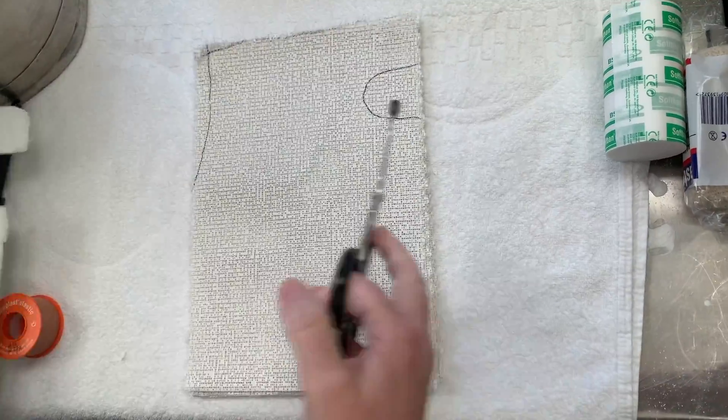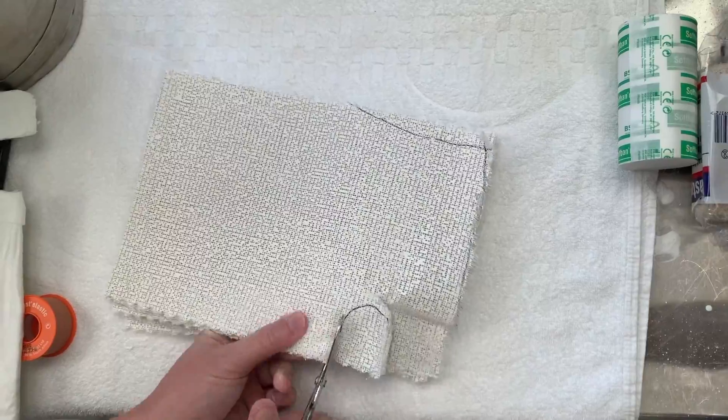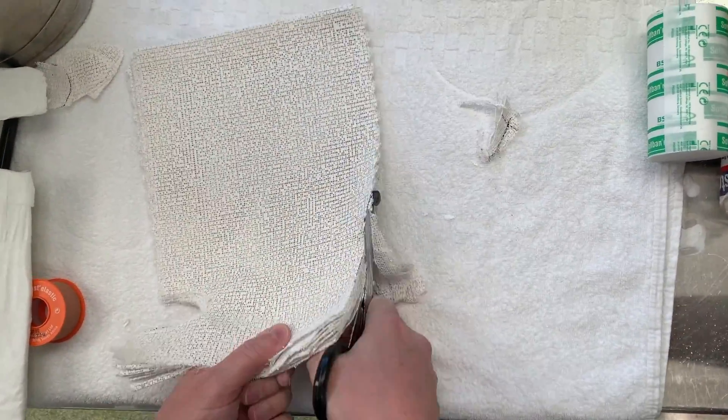We're using one packet of the 20cm plaster of Paris, which makes approximately 10 plies, and cut it to the template provided. The length of the backslab can be adjusted according to the size of the patient's arm.